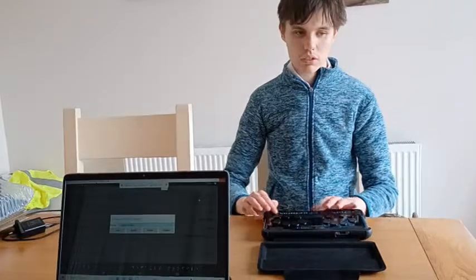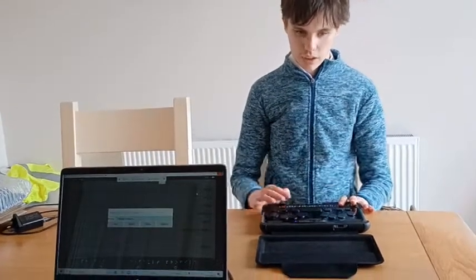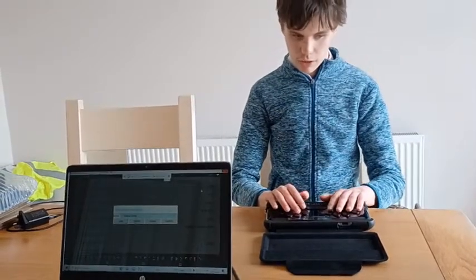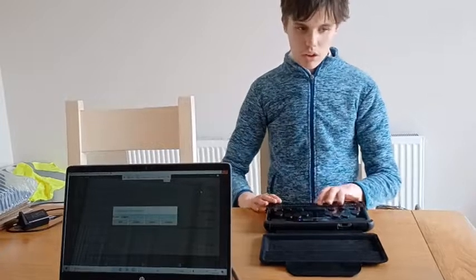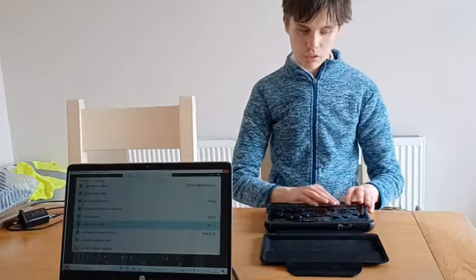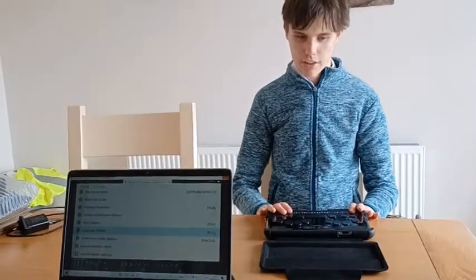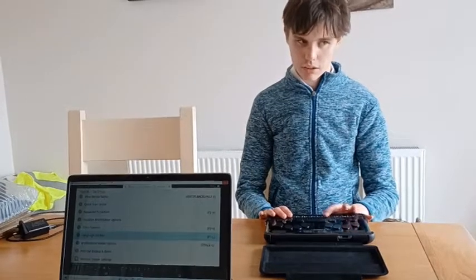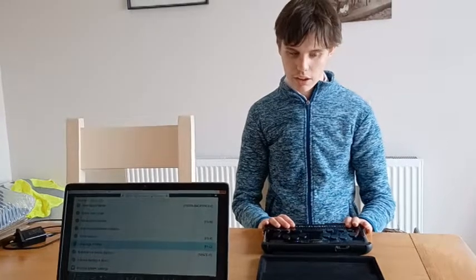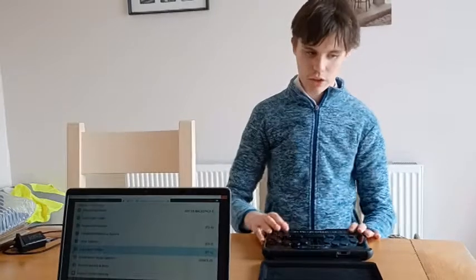Profil, default profil simple list item. And I want to set this back to English. So all I need to do is press E, but you can scroll as well if you want. English 2 simple list item. And then all I need to do is press enter. Language profiles L. And just like that, the code has been changed back to English. My Braille input grade is back to contracted Braille, and it is now ready to be used in English.